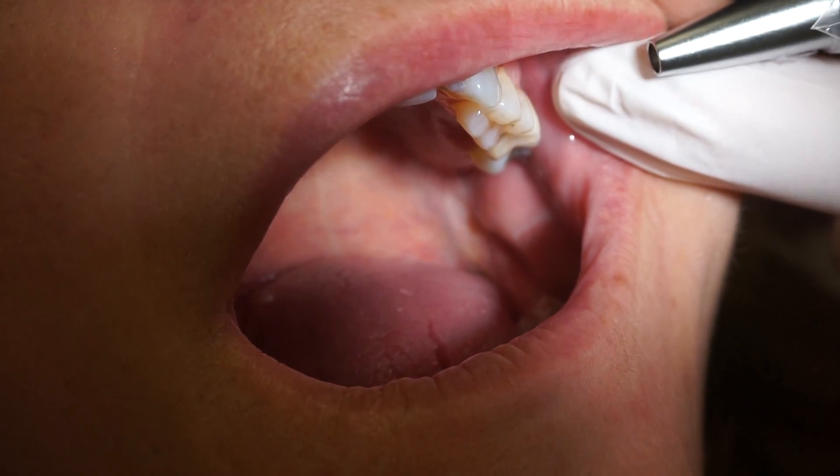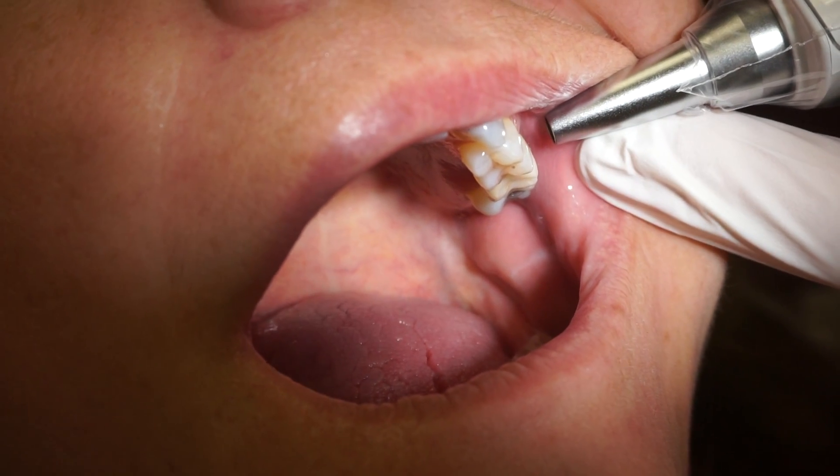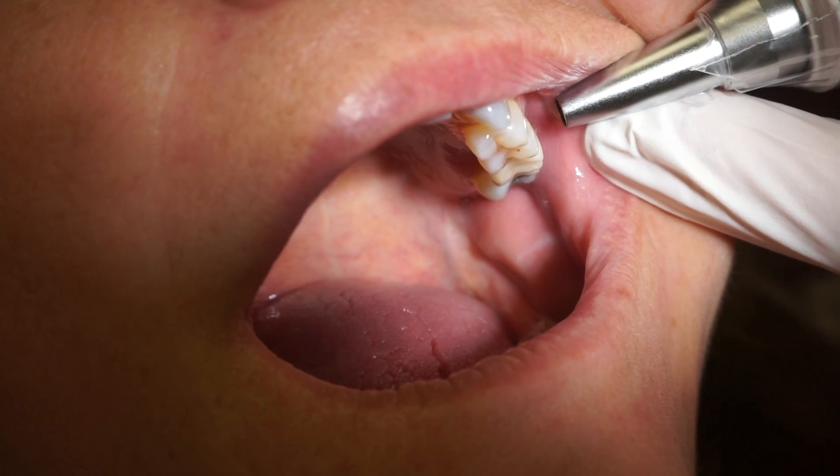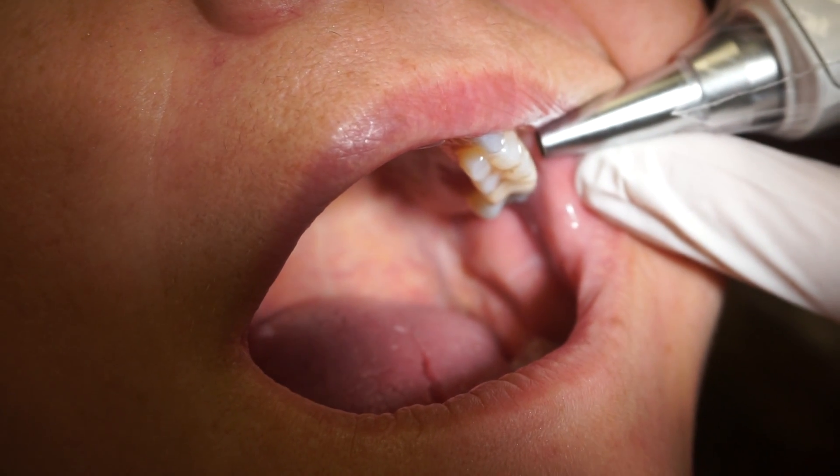So when you're doing this, you need to make sure you hold this parallel to the floor. You can use it on the crown, on a healing abutment, on an impression coping — it doesn't really matter. But you want to get it about a millimeter or two from the tooth.